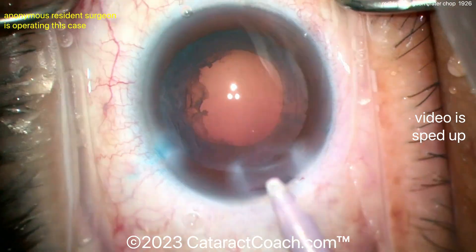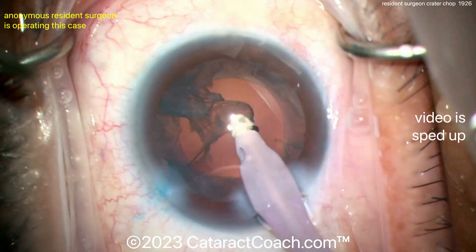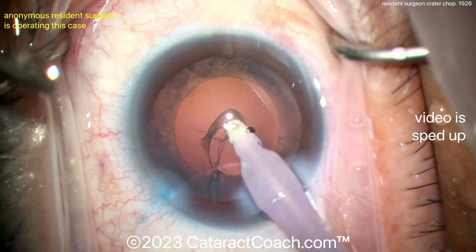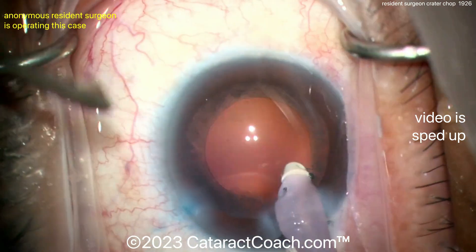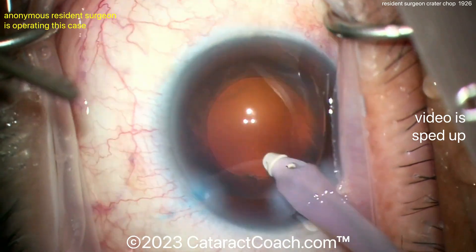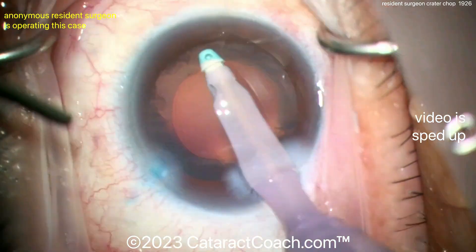Nicely done. You can see the incisions — I like the placement of them. That main phaco incision is pretty good; the left side of the incision is a little avascular for my liking, but I'm still very proud of this resident for case 100. That's fantastic. Cleaning up the cortex here — that's pretty straightforward and that's a nice looking rhexis. The rest of the case is going to be pretty routine.